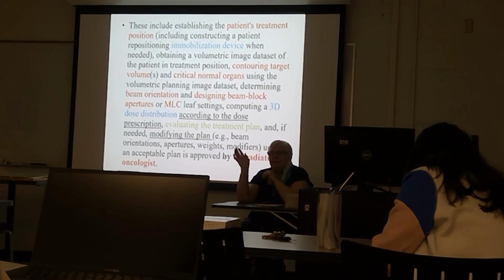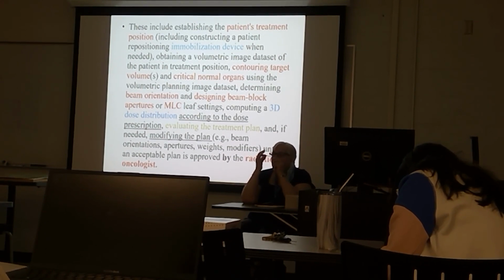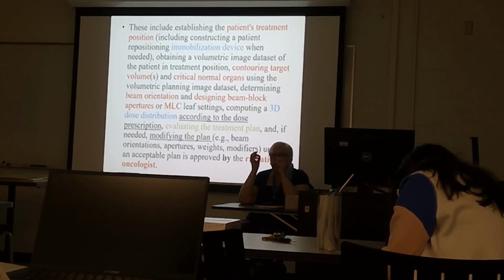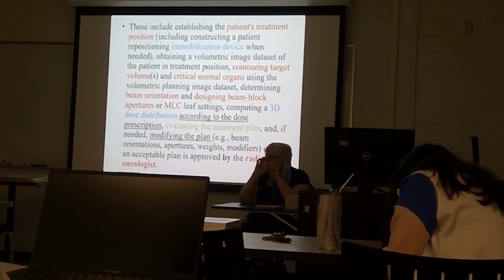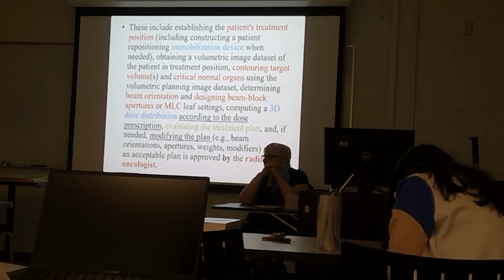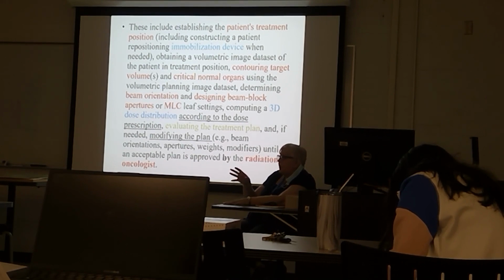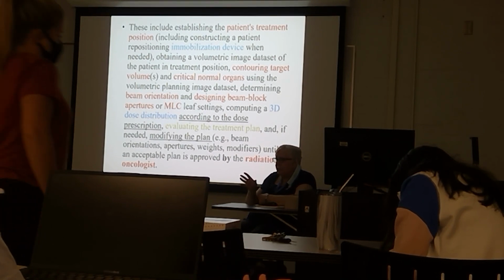Fiducials, just because you mentioned it, are anything that is put either on the body or in the body to help you position. So they ignore it a lot. Like, what are those? Oh, those are the fiducials, and then they just align it to other things around. Well, it depends on what we're using fiducials for.